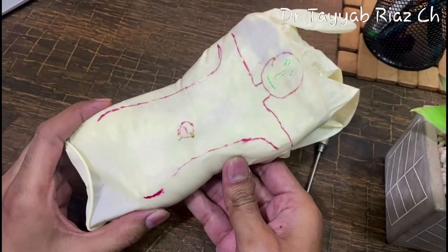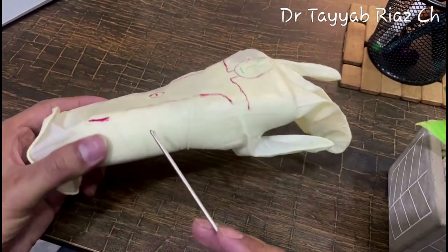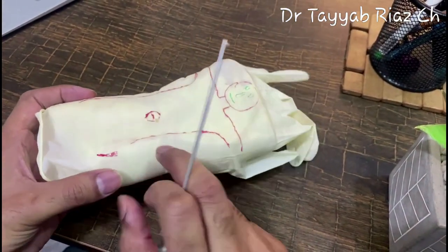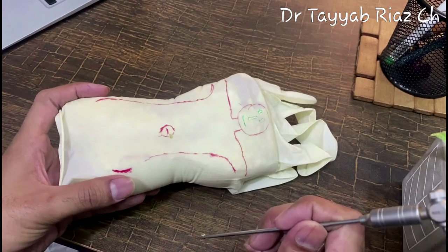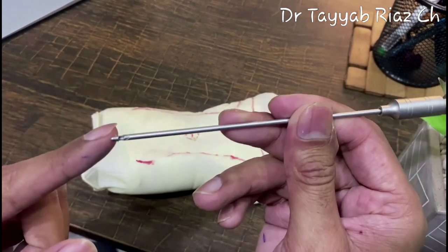Now I am going to demonstrate on this model how to insert the Veress needle. Suppose this is the skin, this is the abdominal wall and this is the peritoneum, and this is the thickness of the abdominal wall. Now before inserting the needle, you should know how much distance from the tip of the needle you should hold it.